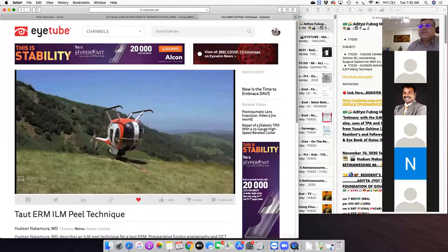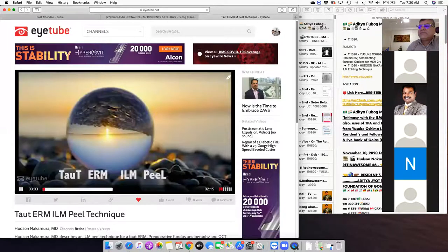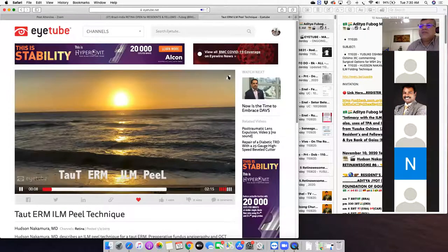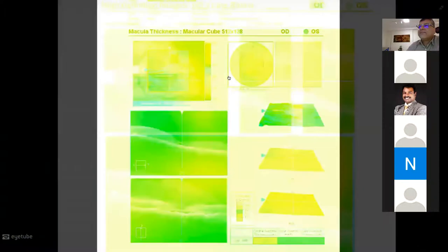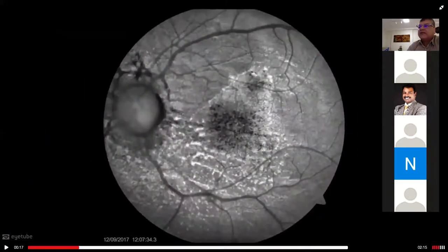We proceed to another video — taut epiretinal membrane with ILM peel. That's a case designed for taut epiretinal membranes. It's always interesting to have the autofluorescence because you see how deep the membrane is standing there. If you just look from the indirect towards the retina, you might see the membrane, but if you don't have an OCT and full angle view, you might not see how deeply the membrane is embedded.